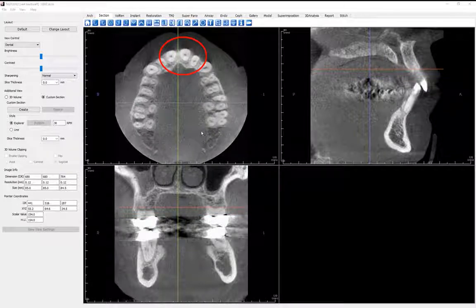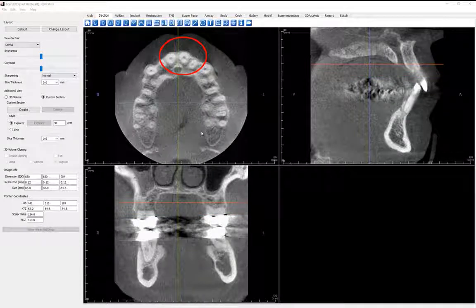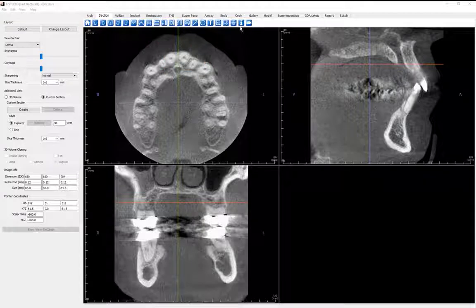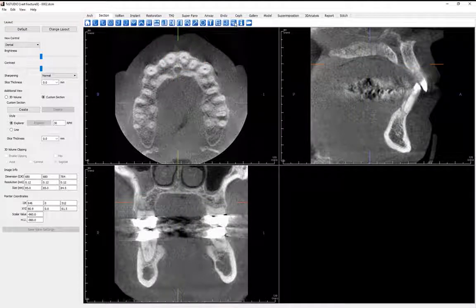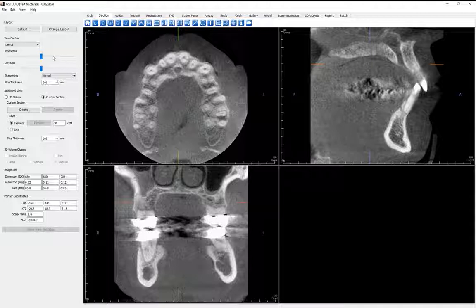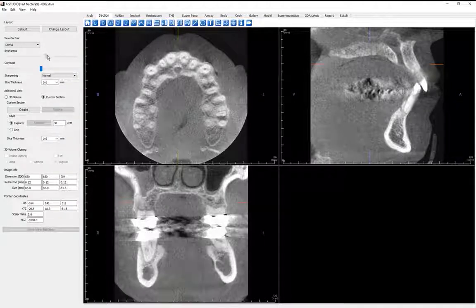Next, mouse click on the toggle cursor visibility icon on the toolbar to place the cursor lines behind the slice. Let's use the brightness and contrast sliders as well as the sharpening tools for greater clarity.